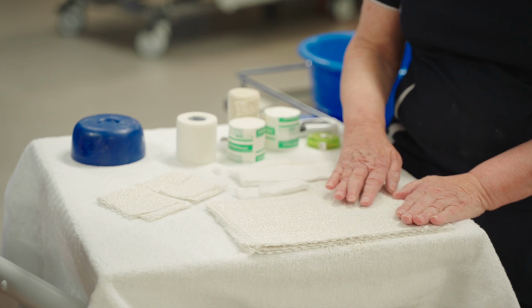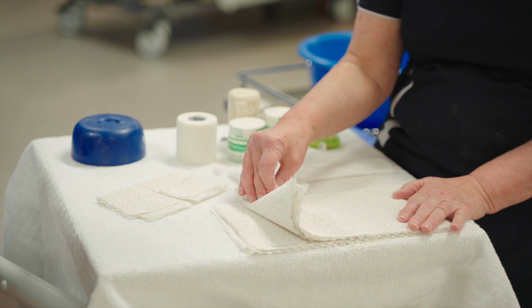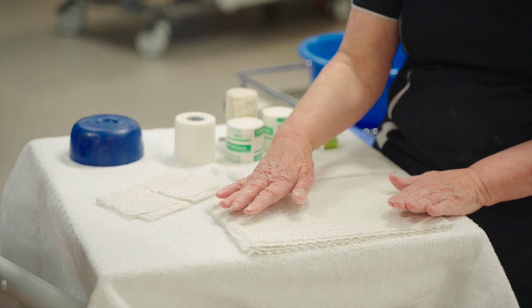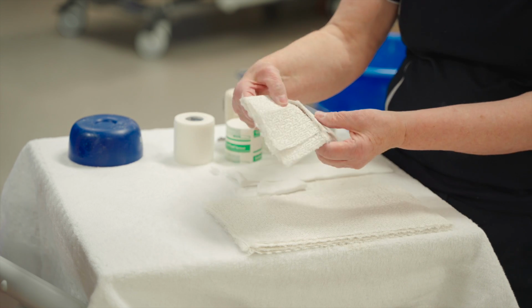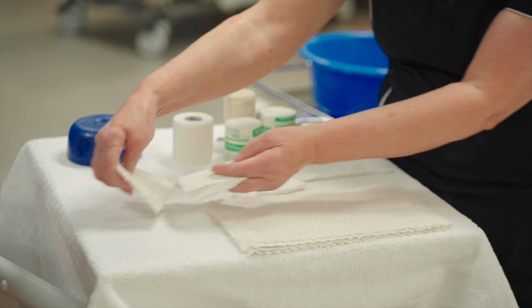The slab that we have here is a 15 centimetre gypsona and the number of layers you will need are 10. 10 is the set standard for the Royal Adelaide. It can go 6 to 8, but we prefer 10. You'll also need another piece of gypsona that you have folded into 3 or 4 layers and that you have a split in the middle.